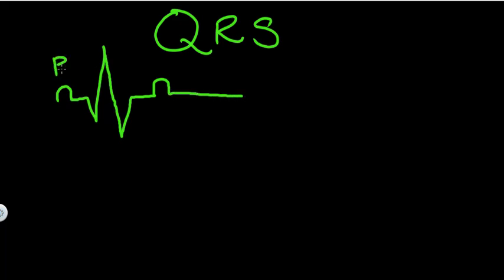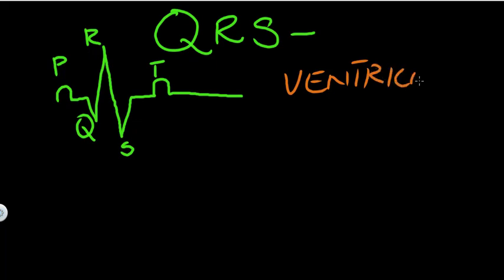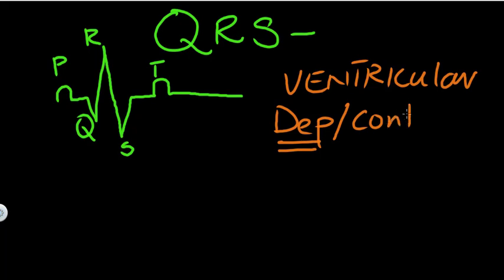This is your PQRS T. Now, this is your QRS complex, which basically represents your ventricular depolarization. I'm just going to write DEP or contraction.